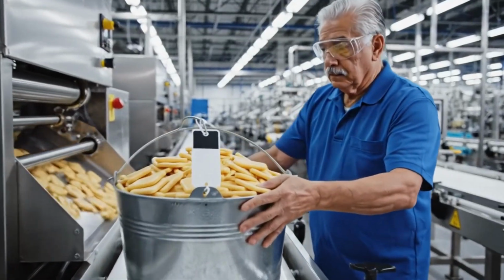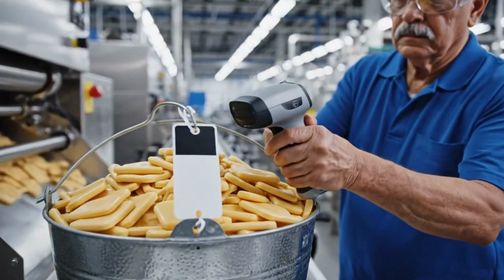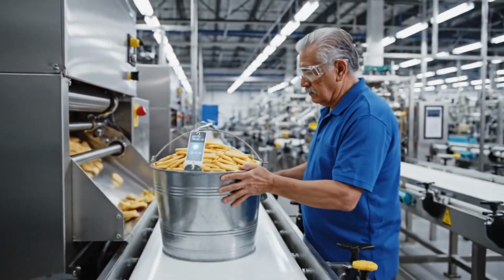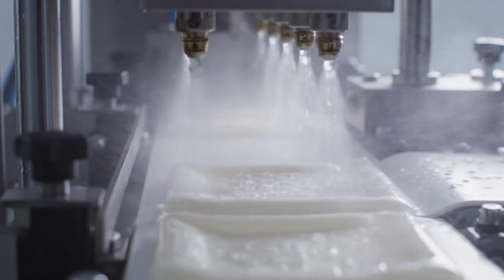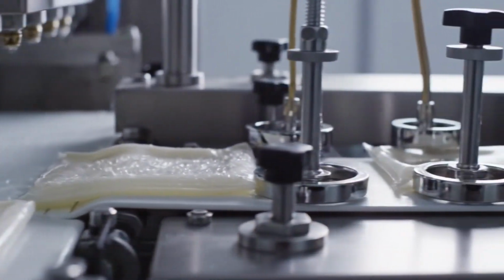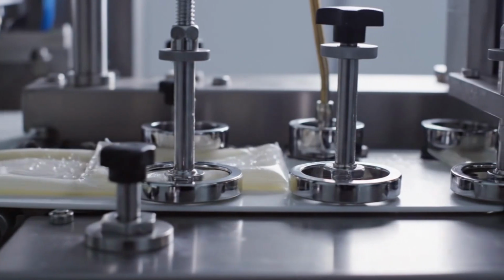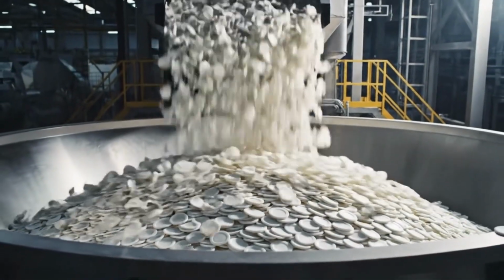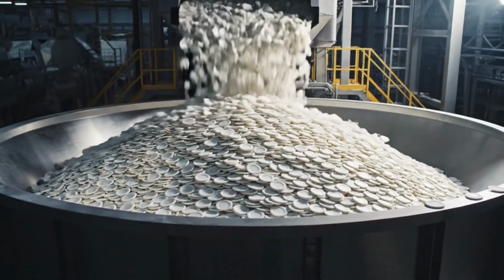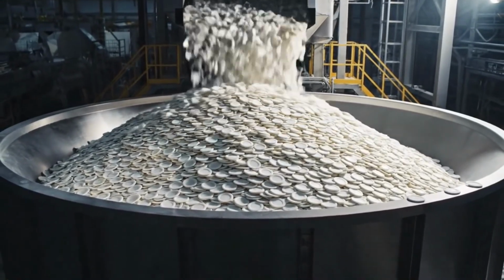Quality control starts before the machines even finish. We monitor the wet strength of every batch in real time. Every layer of protection added here ensures the final product is a medical-grade barrier. Phase 2 is complete. What began as a liquid has been molded, cured, and strengthened.